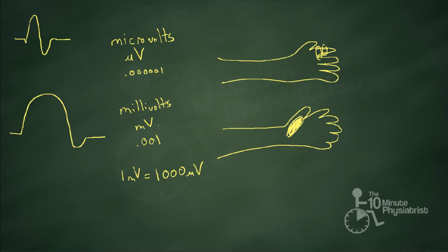Now you might say, why does that matter? The machine makes the setting for you. You don't really have to remember that. What practical use does that have? It has a little bit of a practical use. Again, if I set you loose in New York and said, go find the Beethoven statue, you could wander around for days. If I set you loose in the EMG lab and you were a little anxious or had a particularly anxious patient, or maybe your technique is not quite up to snuff, or your machine's not working quite right, the sensory nerve action potential will be inherently more difficult to obtain.